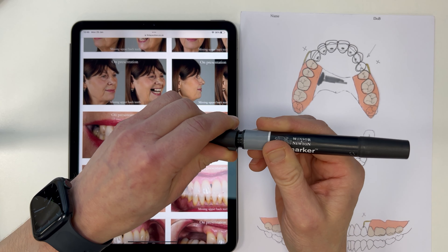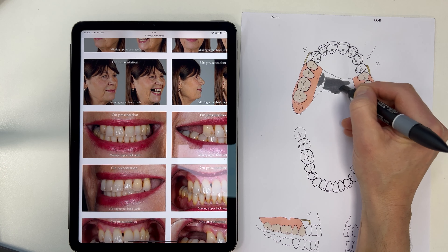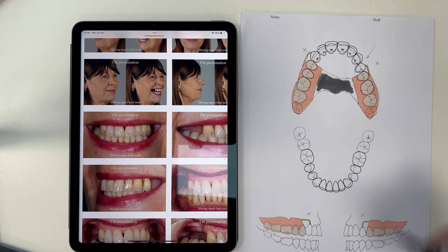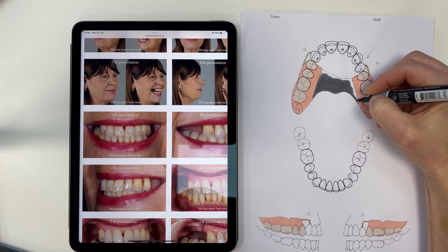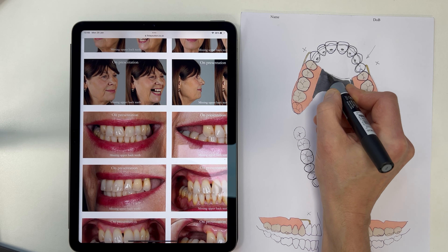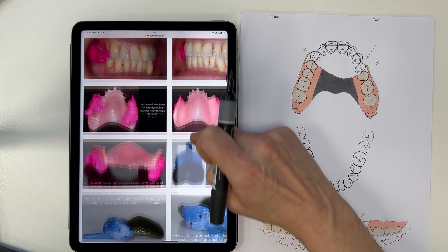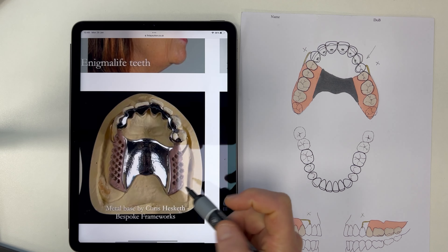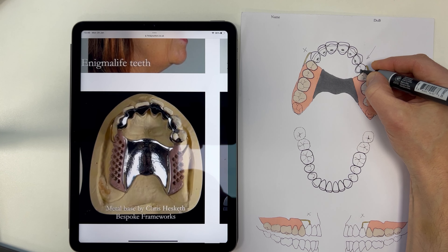I can turn these markers over — they're great because I've got the thick chisel end just to colour that in, doing the main bit. This will be the framework of the metal. There'll be a mesh that extends from this area into the denture underneath. If we fast forward right through to the metal framework, it's going to look like that — with metal mesh extending underneath there, and then the metalwork extends onto the top of the teeth just like that.